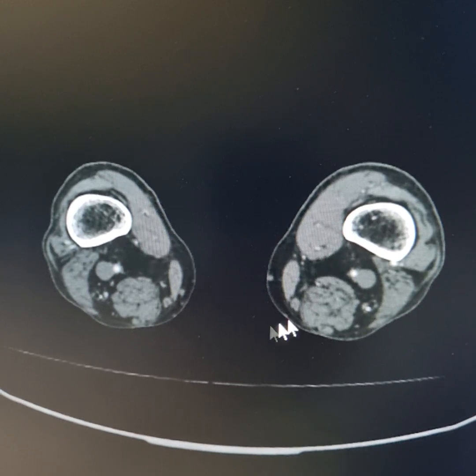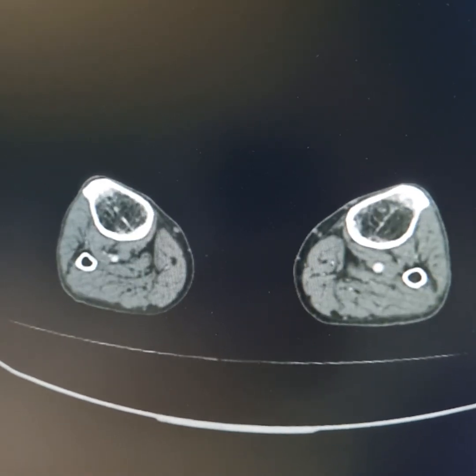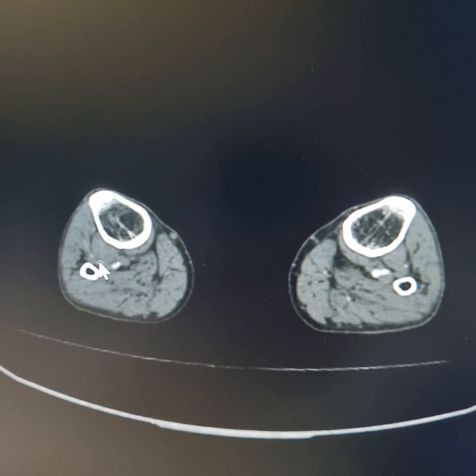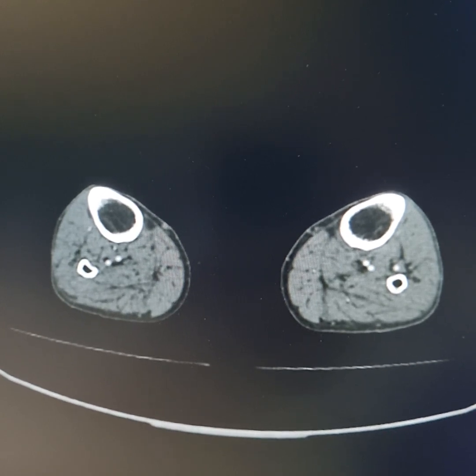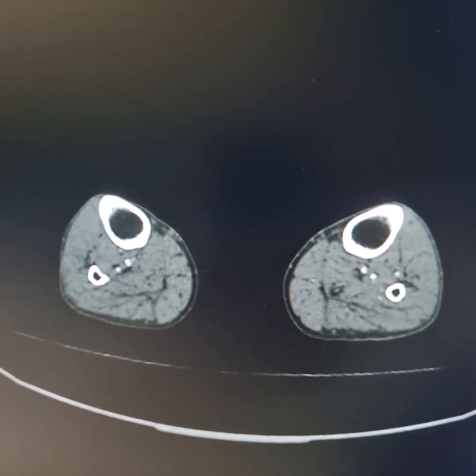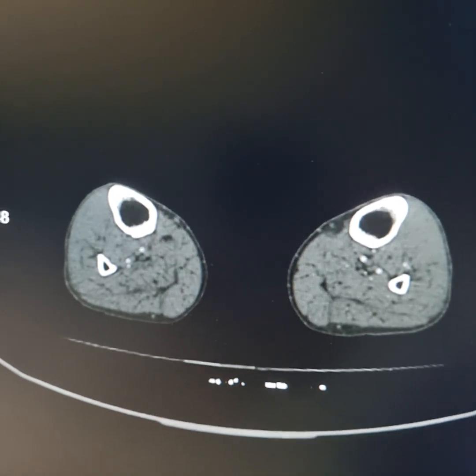This is the popliteal artery. Its lumen is patent. Please trace it down. Now, this is the anterior tibial artery. Its proximal part is patent. This is the tibioperoneal trunk here. Now, the anterior tibial artery is completely thrombosed, as is the dorsalis pedis artery. Now, this is the posterior tibial artery. Its lumen is narrowed. This is the peroneal artery, this one here.